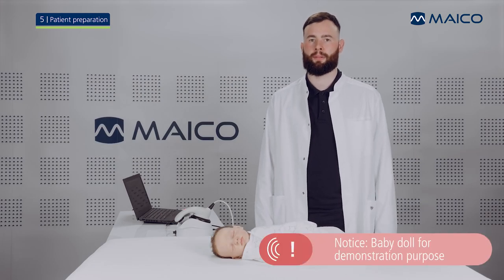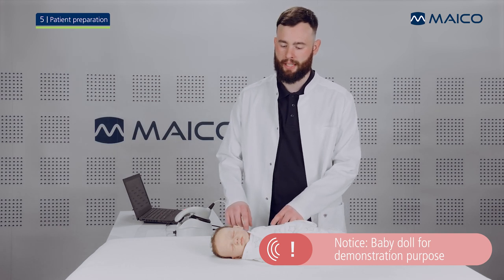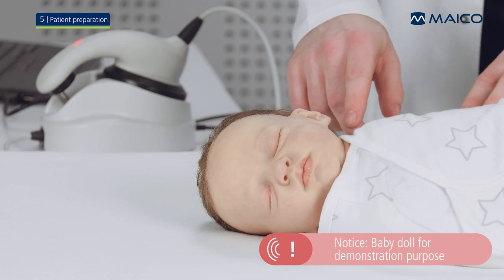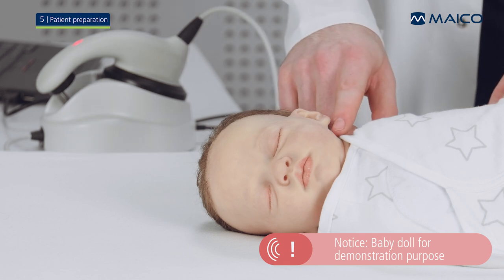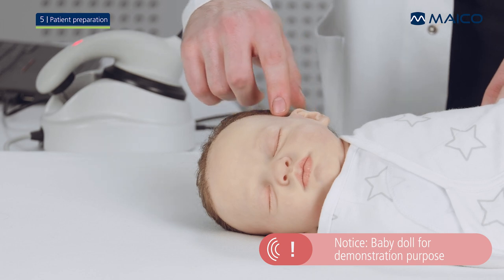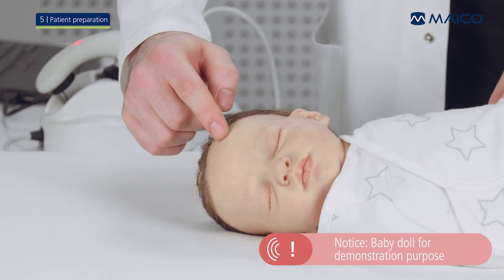The baby needs to be prepared before a measurement. Locate the spots on the baby's head where the measurement electrodes of the Barafone will be positioned. The mastoid electrode will be placed below the ear, the ground electrode right above the ear, and the vertex electrode on the forehead approximately three fingers away from the ground electrode in front of the hairline.